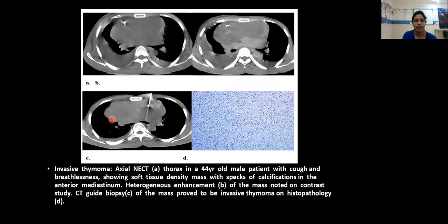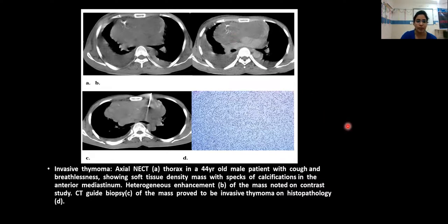These images show a 44-year-old patient with cough and breathlessness, with a soft tissue density mass with speckles of calcification in the anterior mediastinum. Heterogeneous enhancement of the mass is noted on contrast study. CT-guided biopsy of the mass proved to be invasive thymoma on histopathology.